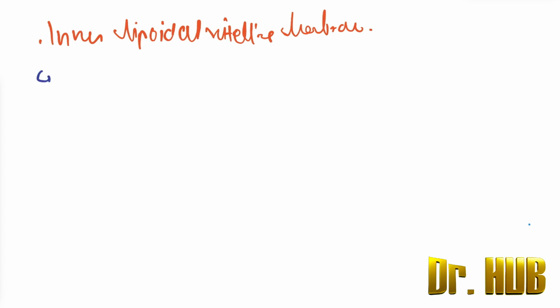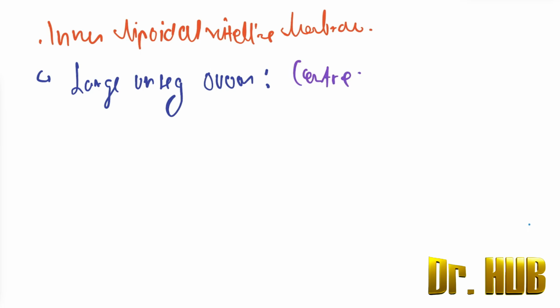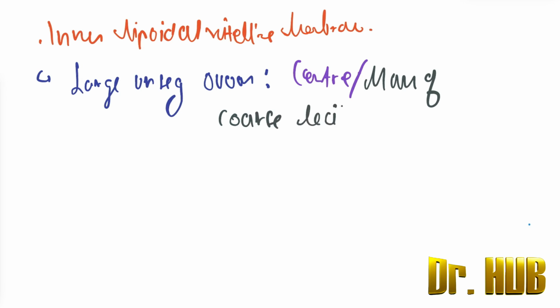Next, there is also the large unsegmented ovum, present at the center, and it contains a mass of coarse lecithin granules.